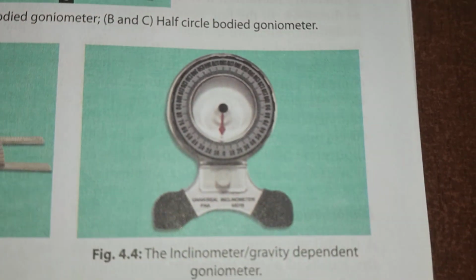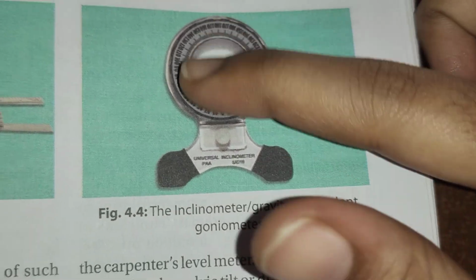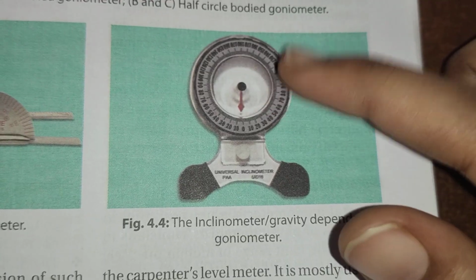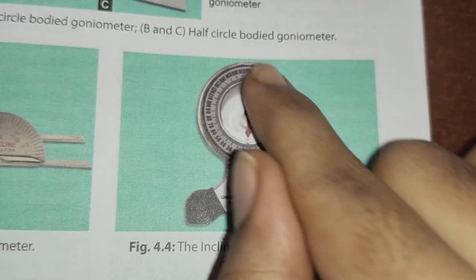It is a gravity dependent goniometer. It has a pointer and it's filled with air bubbles. Whenever we want to check the angle of measurement, we see the deflection in the angle.